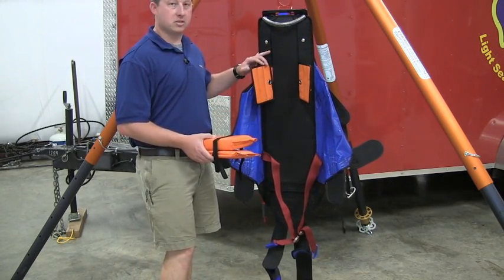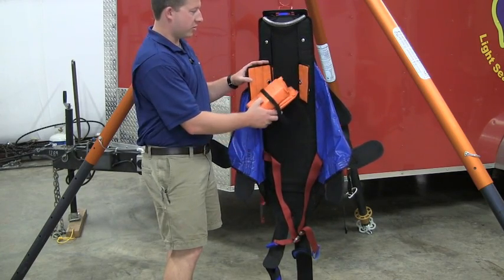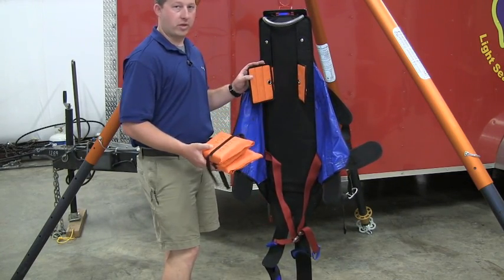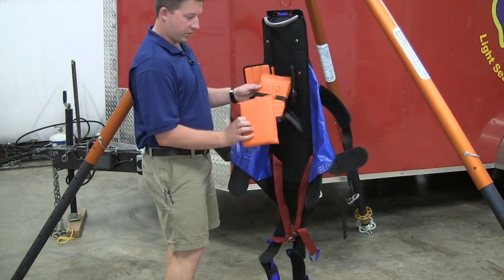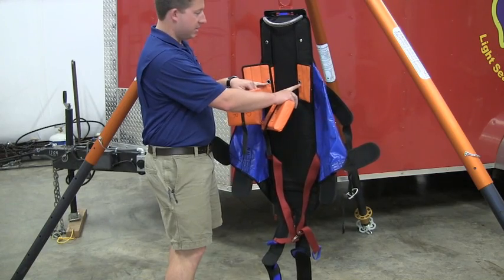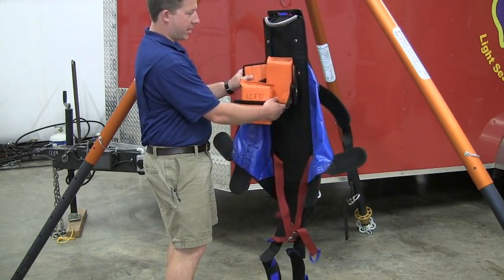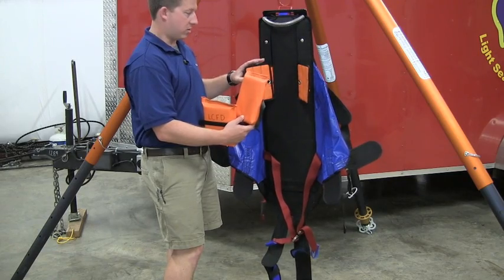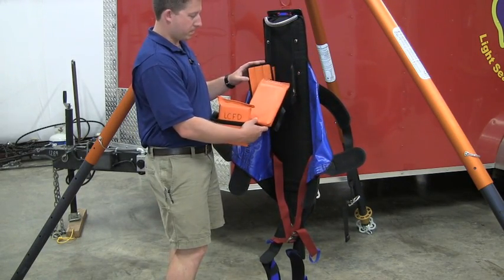When you place a patient into the Spec Pak, you have a couple of different head pads that come with the device to give them a cushion depending on the size of the patient, whether they have a helmet on or not. They have a Velcro strap, and you feed the strap through this eyelet, and it keeps the head block in place. So the head block will slide up and down with the cervical collar and the entire C-spine immobilization system.